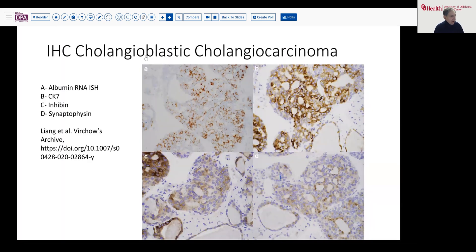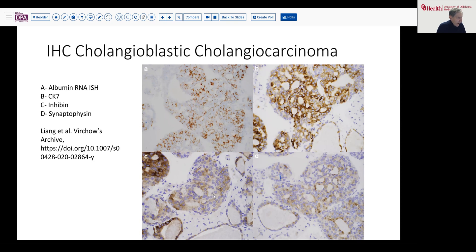Here's a nice example of what those things look like, taken from a publication with a composite slide. You can see what the messenger RNA in situ hybridization looks like, where it's looking at the albumin messenger RNA. Here's the CK7, as we'd expect, and inhibin shows variable strong and weak positivity, but definitely positive.